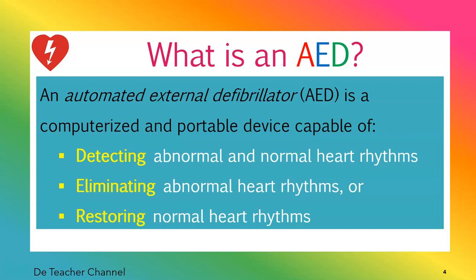That's it. It is a machine, but it is computerized. It means that it has some degree of intelligence. And with that, it can detect if the heartbeats are normal or abnormal.